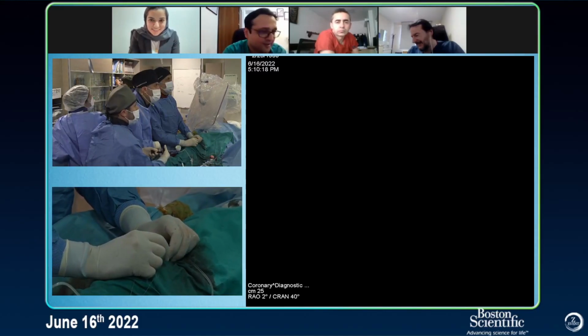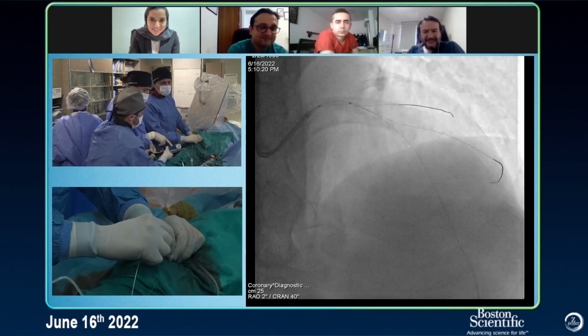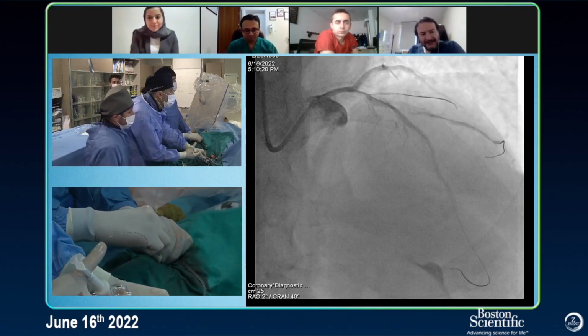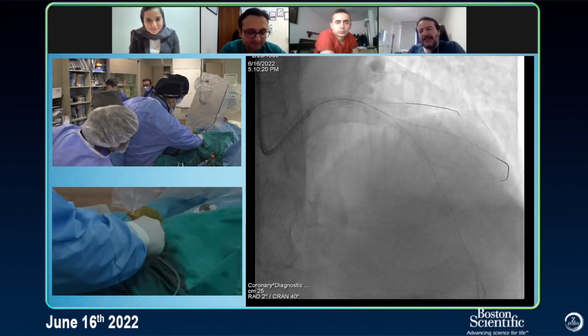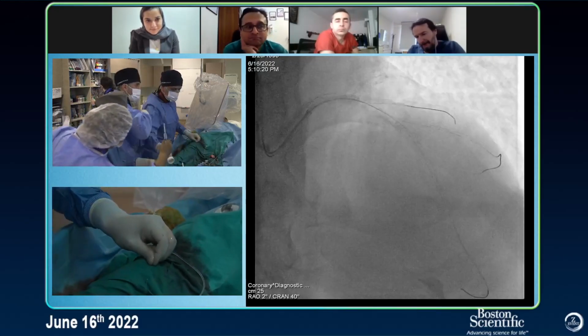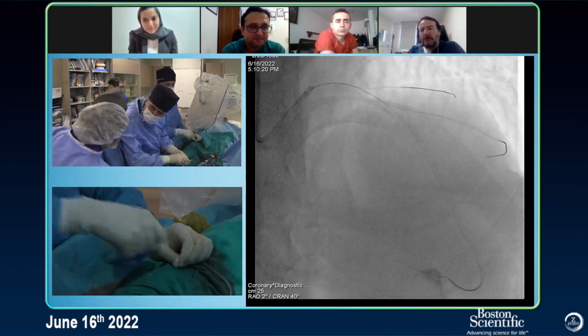And he already said he's not ready. Yeah, ruptured, no problem. So it ruptured at 20, right? Yes, okay, this is a good sign. It's a good sign that you need more plaque modification. So that was the reason why I wanted to see the IVUS after rota. Maybe we would have gone directly with the scoring balloon before the NC.